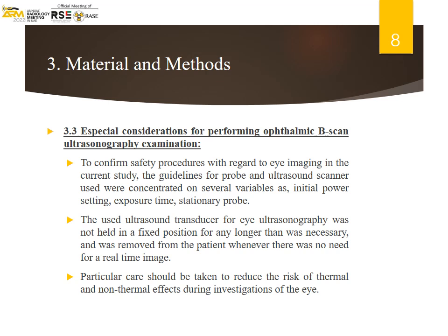Special concerns for ophthalmic B-scan ultrasound. To establish the safety of ocular imaging in the current study, the probe and ultrasonic scanner instructions focused on initial power setting, exposure period, and stationary probe. The ocular ultrasonography transducer was withdrawn whenever a real-time image wasn't needed. During eye exams, thermal and non-thermal risks should be minimized.